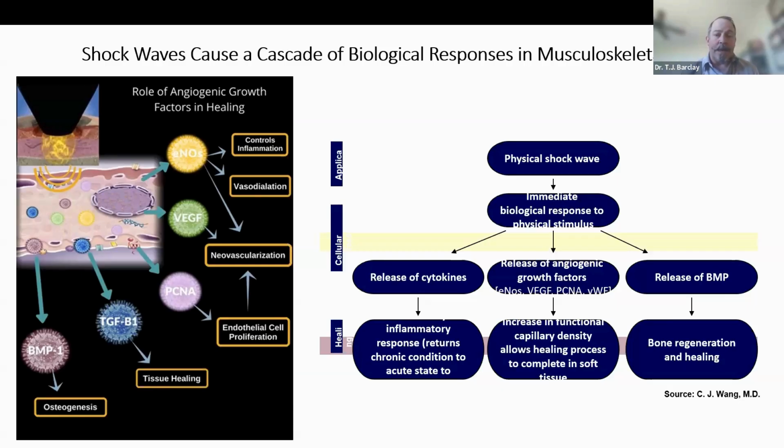So shockwave tends to take a chronic inflammatory response and decrease that overall level of inflammation, and to some extent revert it to more of an acute state on that cellular level. And that's the way we keep the healing process invigorated, by upregulating a few of those acute inflammatory mediators.